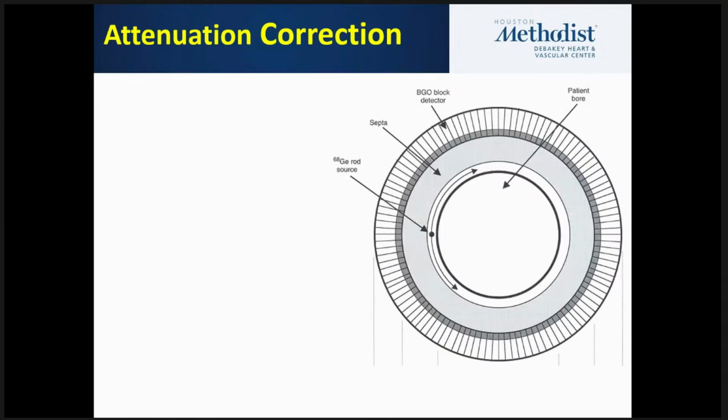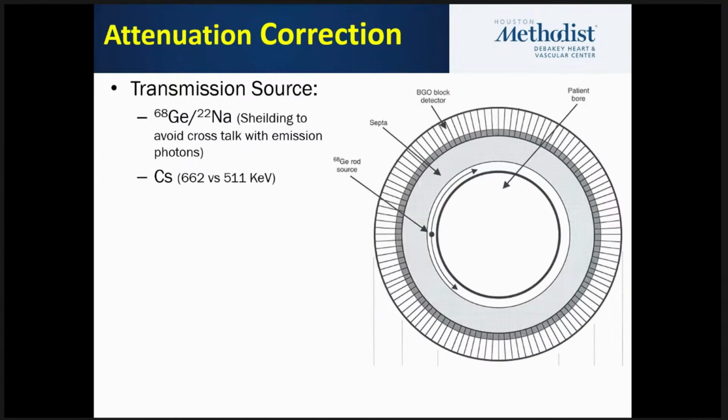However, there are certain things that are very important in PET. One which is very important is that we always would like to do attenuation correction in PET compared to SPECT, because these gamma rays are going through different tissues, so even in the best situation, there will be some attenuation to them. And we would like to know through what milieu they're passing before reaching the detector, to take that into account.